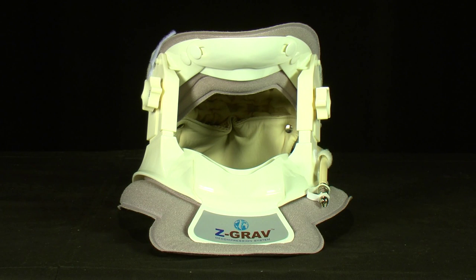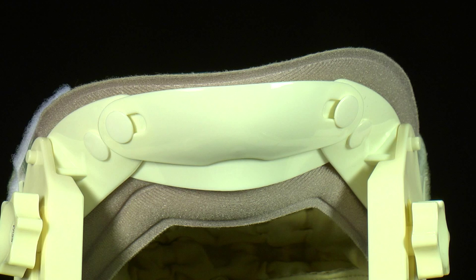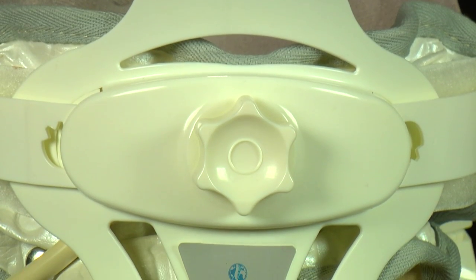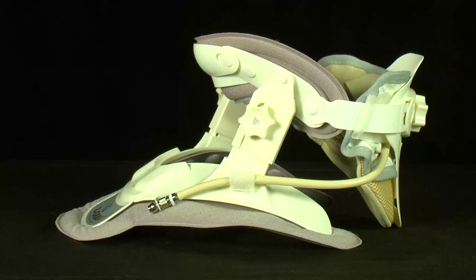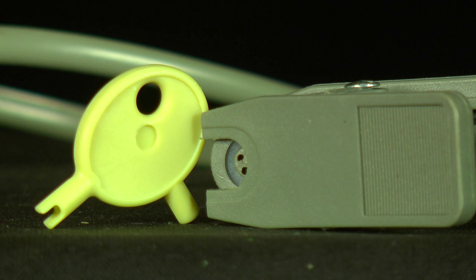The collar has a front and rear component. The front can be identified by the Z-Grav logo and the chin cup. The rear component has the Z-Grav air columns, curve stabilizer and inflation tube. The rear component valve and inflation tube are on the left side. The silver valve may rotate right or left to either retain or release air. The valve key is used when releasing air to deflate the air columns quickly and is the preferable method of air release.